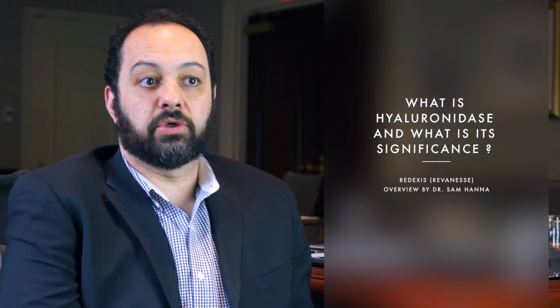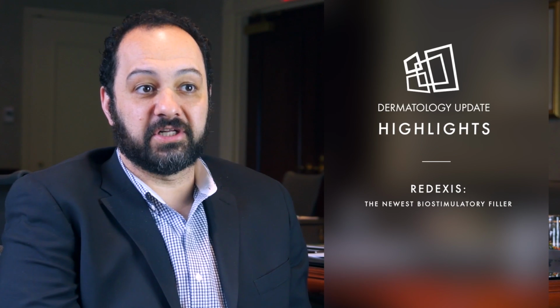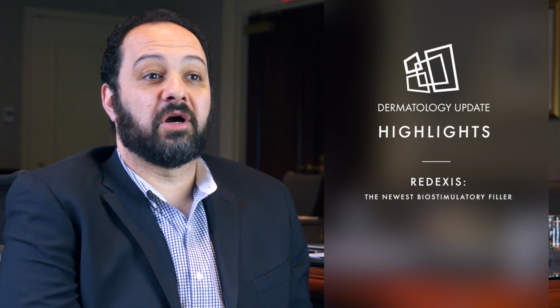Well, one of the things that has always been of concern since the early days of filling is if there was an issue, whether an aesthetic issue where you saw a nodule or a bump, or you had a reaction that you didn't want. It was difficult, in the days when collagen is what we were injecting, to know what to do about that. There were a lot of protocols about flushing the area and injecting steroid. Sometimes really the answer with those early fillers was you had to make a little slit and remove them mechanically or surgically or squeeze them out. Obviously not a great outcome when somebody's coming in for a cosmetic procedure.